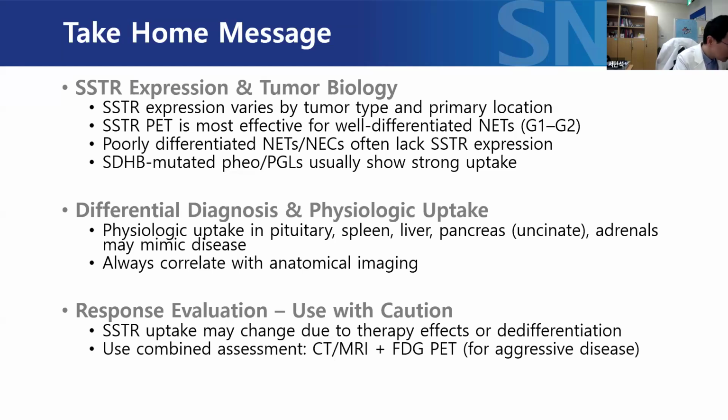So always correlating with anatomical imaging is important. And also for the response evaluation, the SSTR expression may change due to the therapy effects or the dedifferentiation. So a combined assessment is always important in such cases.